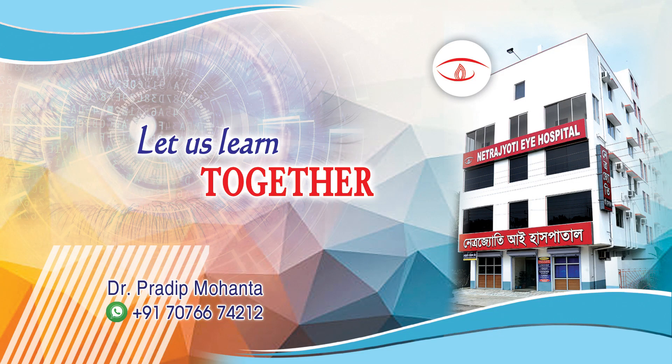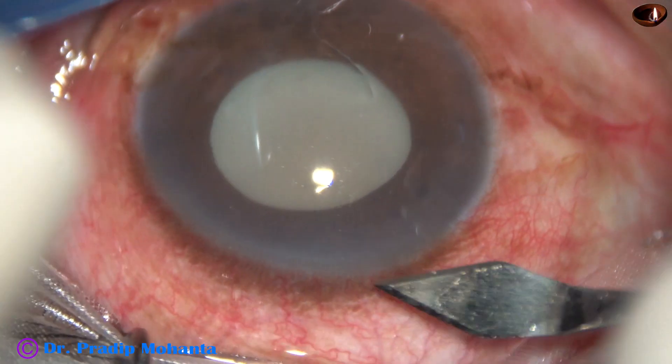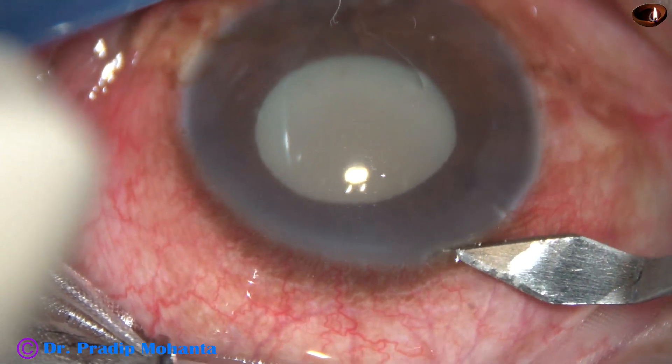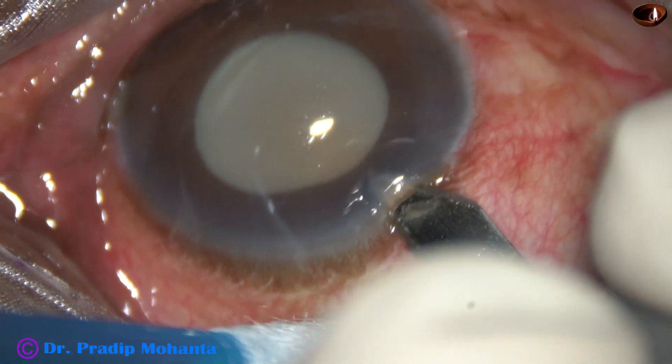Friends, welcome to my workplace at Rana Ghat, West Bengal, India. This is a case of phacolytic glaucoma. The patient presented with intraocular pressure of 60 mmHg. With intravenous mannitol and other anti-glaucoma medications, the intraocular pressure has come down to 36 mmHg, and I have taken up this case for surgery. This is the main incision with a 2.8 mm steel keratome at the mid-limbus at 135 degrees.